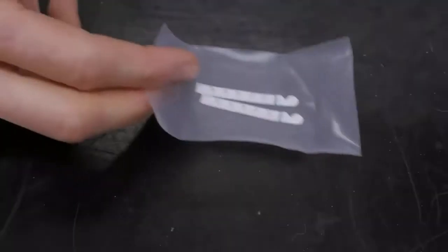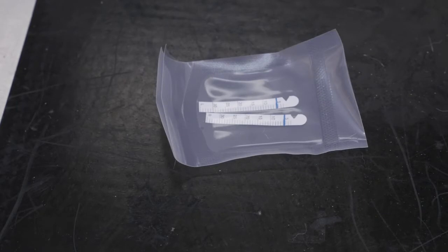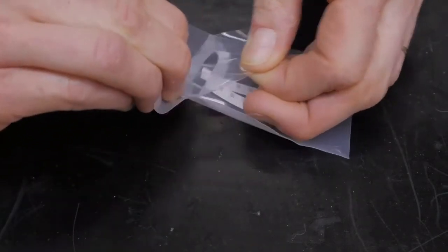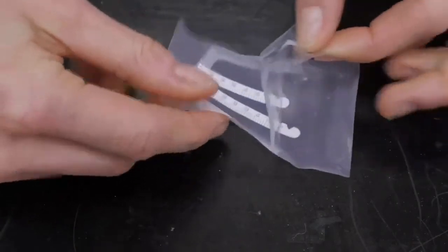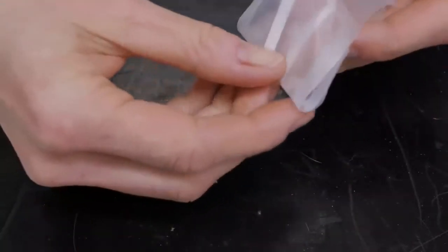The Schirmer tear test. The Schirmer tear test should be performed before any topical medications are placed in the eye, as topical medications will alter the Schirmer tear test value. This test uses sterile absorbent paper strips to measure aqueous tears. To perform the test, the notched end of the strip is folded while the strips are still in the packaging to avoid direct finger contact. This avoids grease or oil contamination of the strip from the examiner's fingers.